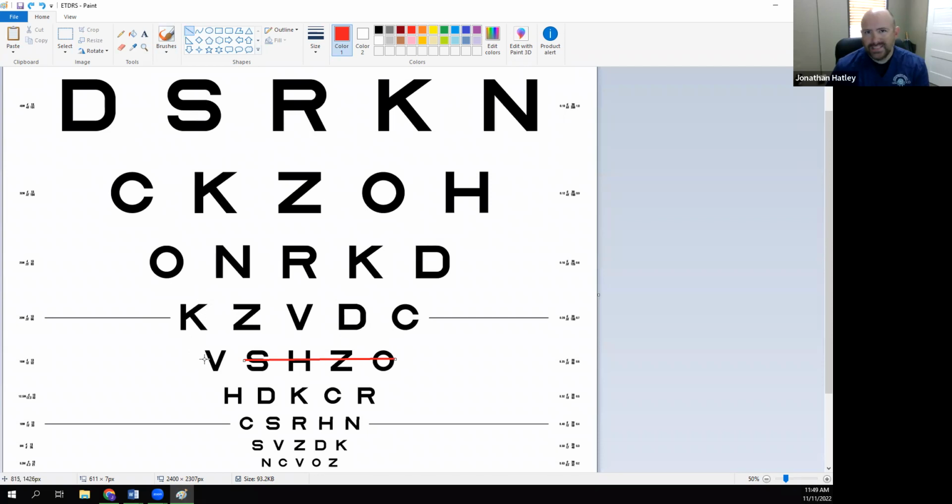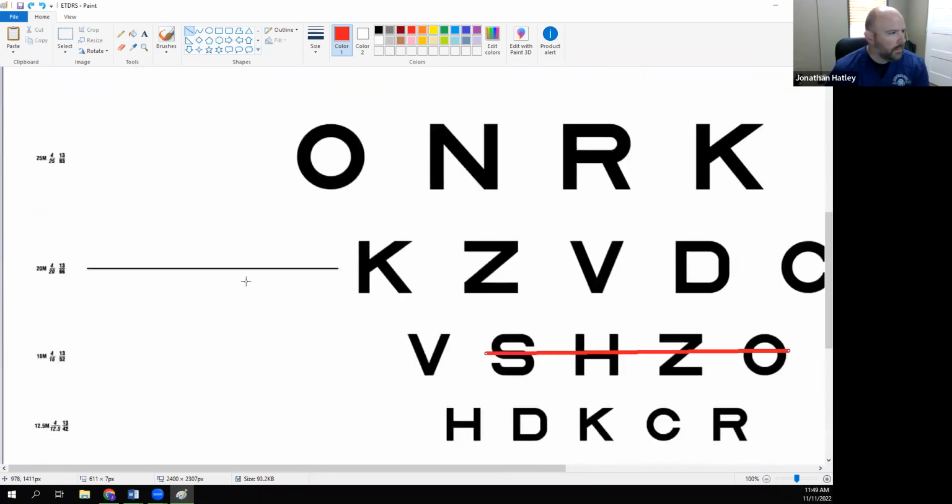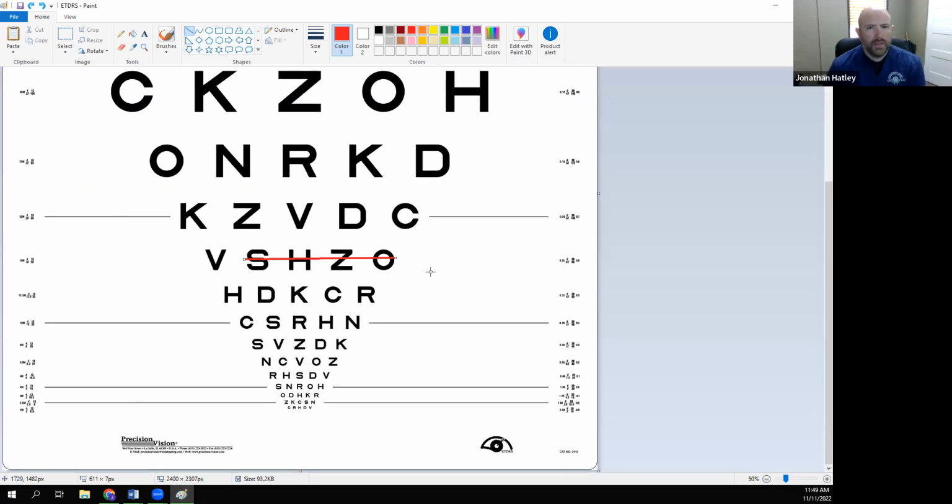So this one isn't as neat or clean as before. And so in this case, it would be appropriate for them to say plus 1. And so the visual acuity in this one, let me zoom in here, is 20M. And so if the test was conducted at 4 meters, then it would be 4 over 20M plus 1. So with ETDRS and M notation, the way that we record the visual acuities is similar to the way that we do it with the Lea Numbers chart.